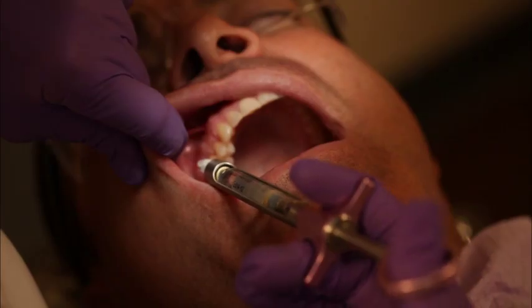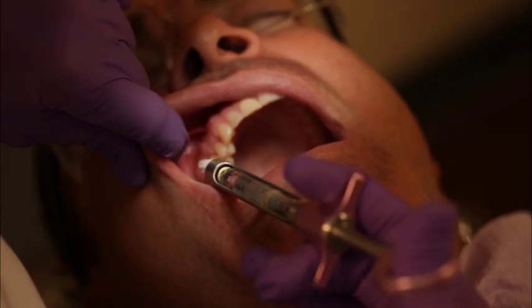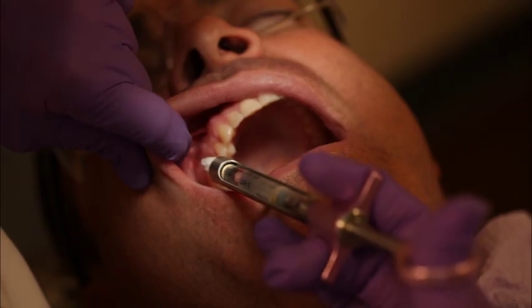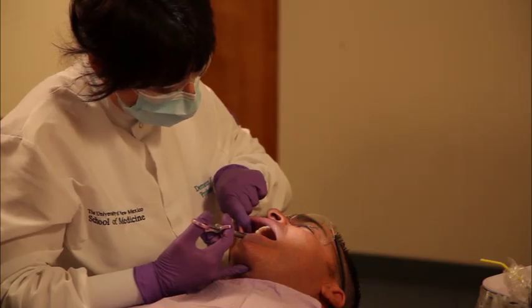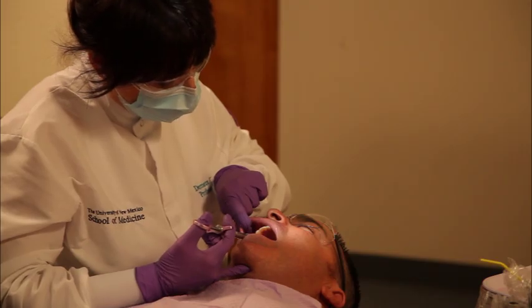Insert the needle at the height of the mucobuccal fold at the apex of the maxillary second premolar, parallel to the long axis of the tooth and approximately 5 millimeters or 1/4 of the depth of the short needle, or until the bevel is slightly superior to the apex of the tooth. You should not meet resistance or bony contact. If a large frenum is present, move the insertion point to a more posterior site.